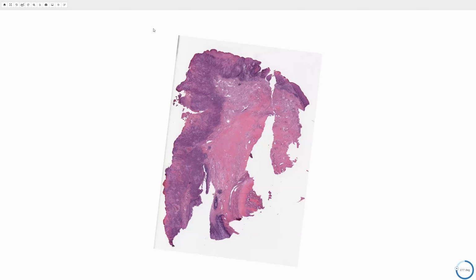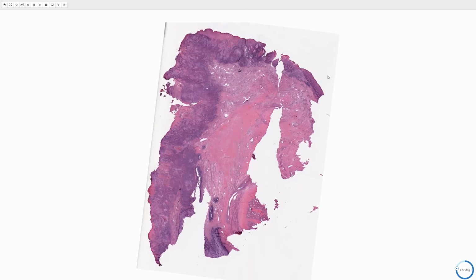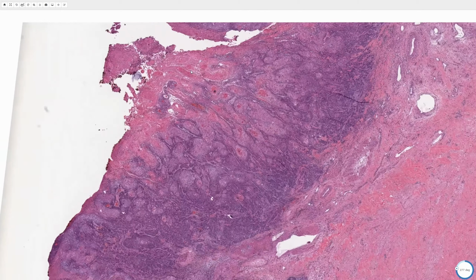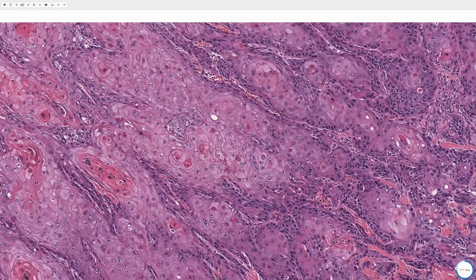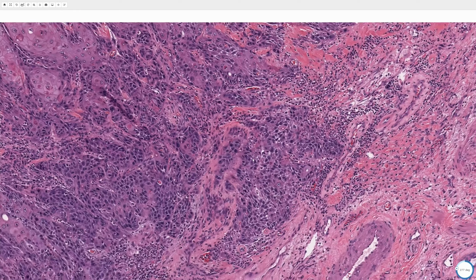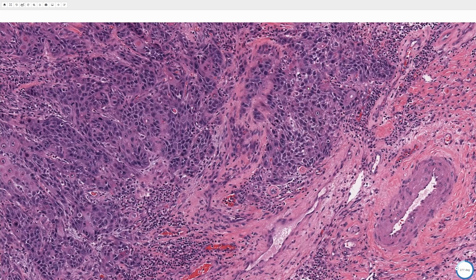All right, now we are moving out of the category of adenocarcinomas and into squamous proliferation. So here you can see that we have a hyperkeratotic epidermis with an adjacent ulceration and a very dense dermal proliferation here that essentially shows evidence of keratinization. So we have keratin pearls and then squamous epithelium, some neutrophils here, dyskeratotic cells, and the degree of cytologic atypia here is quite striking. So there's nuclear pleomorphism and hyperchromasia. And again, here you can appreciate some foci of keratinization.